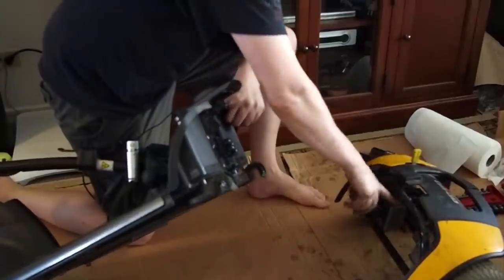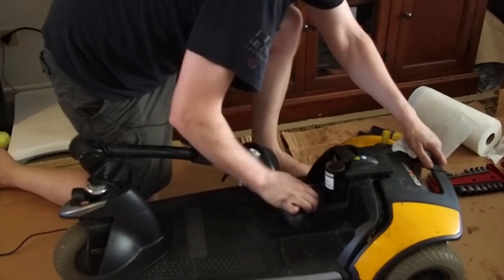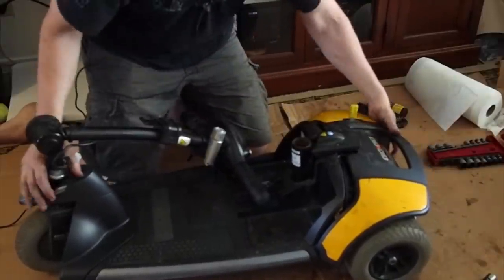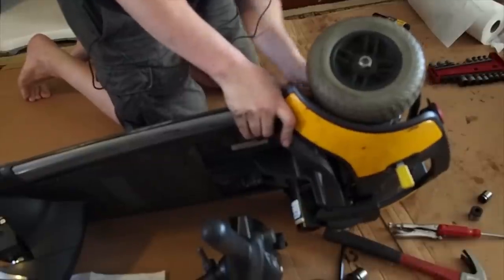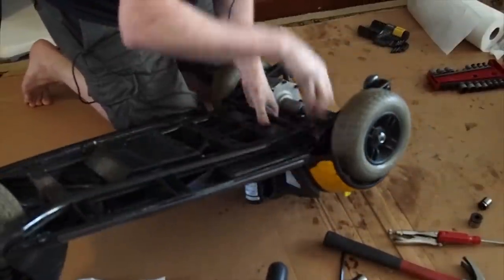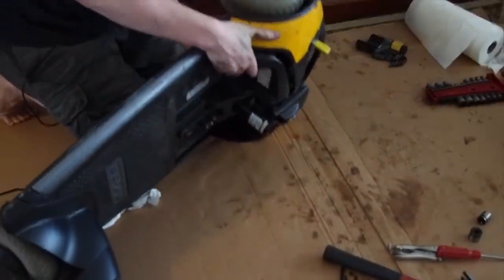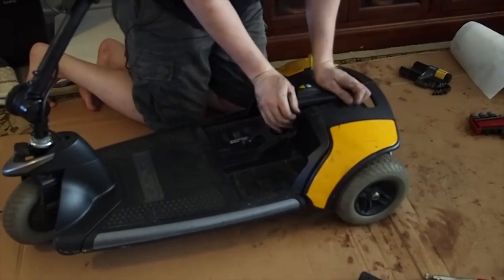So I'm going to connect it, and then I'm going to tighten this down so that they marry up. Okay. Notice it doesn't go together very easily, where normally it does, and it's just because those pieces are not in the right spot. So I probably have to turn it over on its side here and kind of wiggle this around. I can see in there. And I'll try to... there we go. So I got this to line up, and this whole thing locks down.